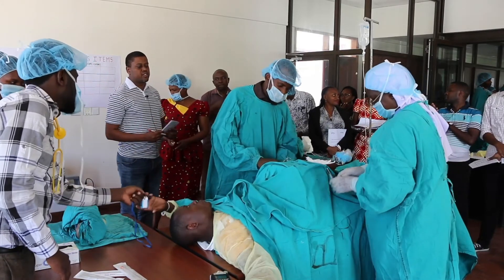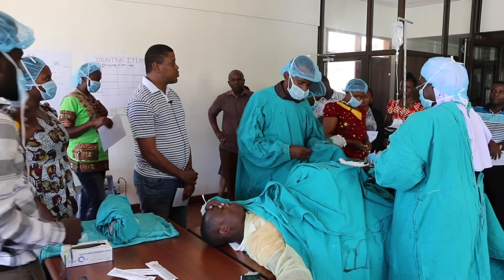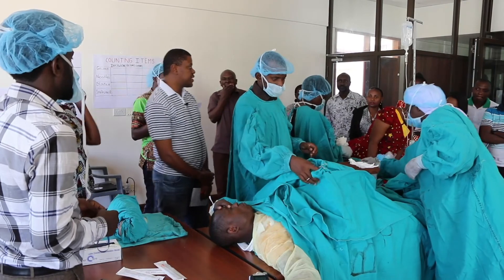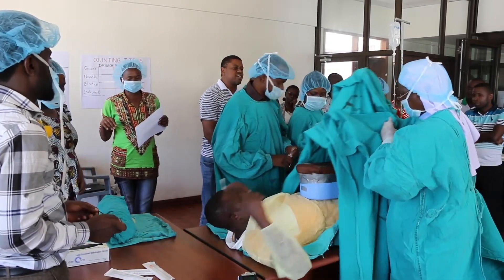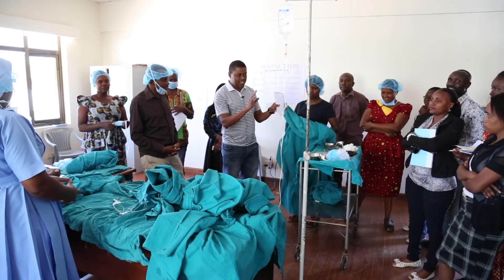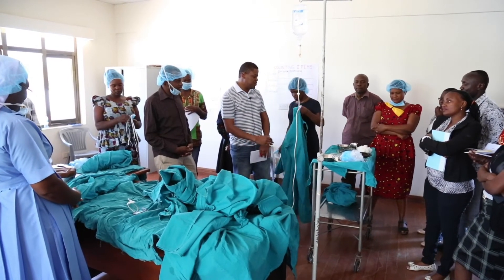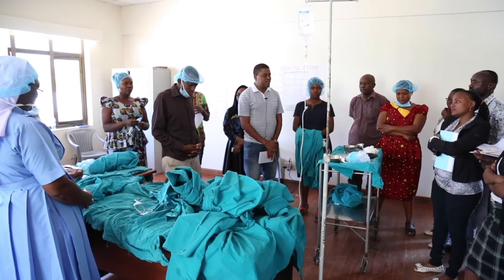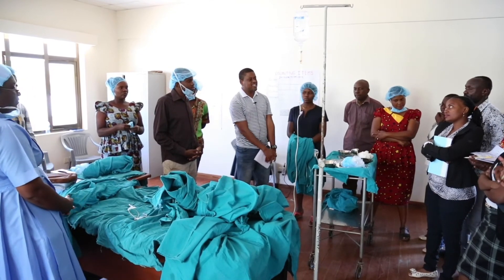At the end of the simulation, the director debriefs with the participants. Now we are going to do the feedback session, providing time for self-assessment and reflection, then allowing observers to give constructive feedback. Observers give the team feedback, starting with what they did well before moving to areas that would need improvement. During the observations, we identify where this team did excellent.